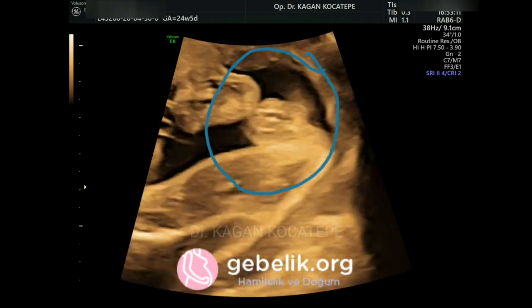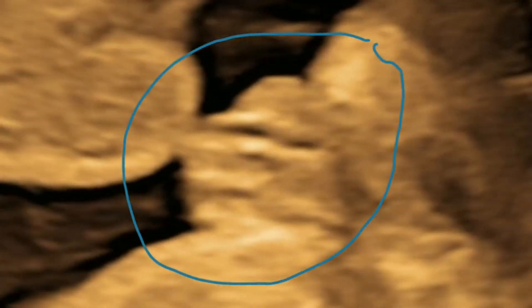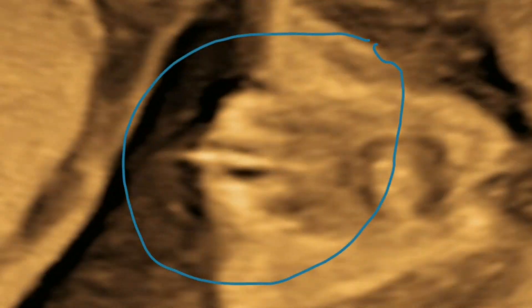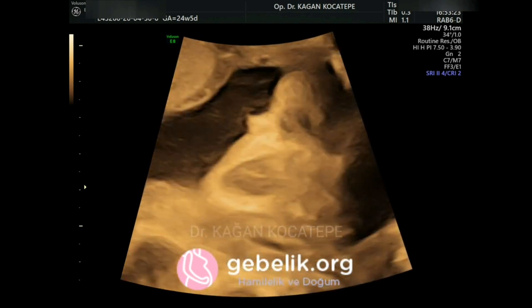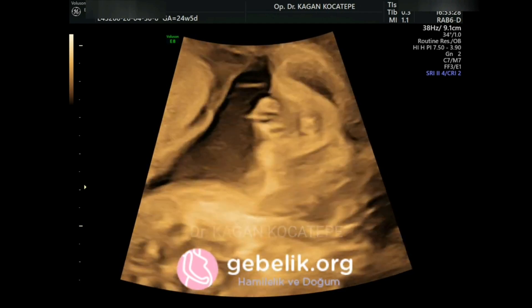vulva of a baby girl. Here we see it very very clearly. Sometimes this is called a hamburger sign because of its shape. This ultrasound will and should never be taken for a boy because it's clearly and definitely a girl.